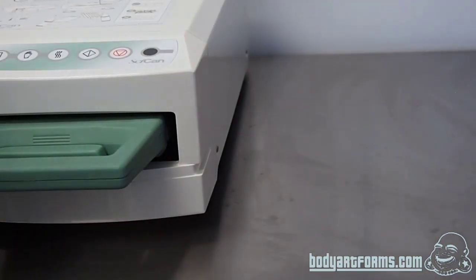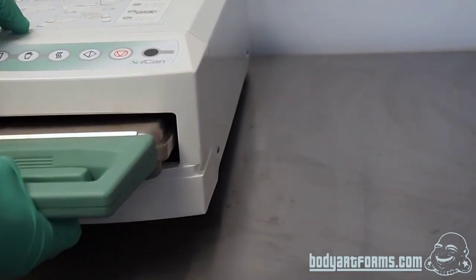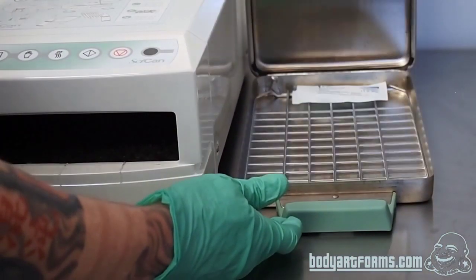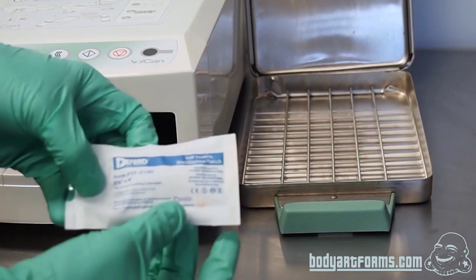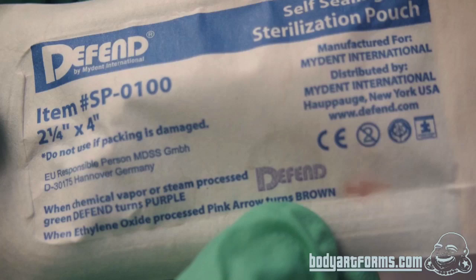Jump ahead to approximately 15 minutes later — our wrap cycle has finished. I'm going to hit the stop button, pull the cassette out, and set it down. We'll open up the cartridge and your sterile items, your packaged items, will be sterilized. As you can see, it has changed colors. I hope that answers all of your questions about sterilization here at Body Art Forms, and hopefully that intrigues your interest to where you go Google for more information.